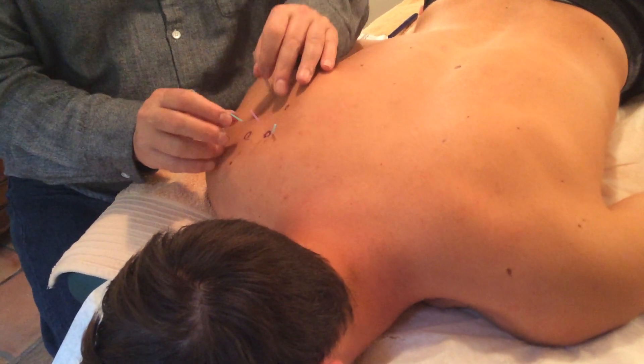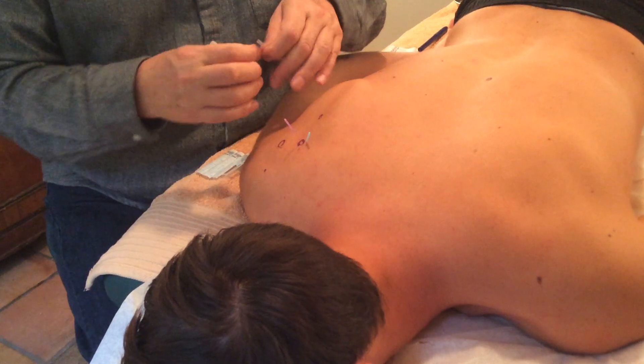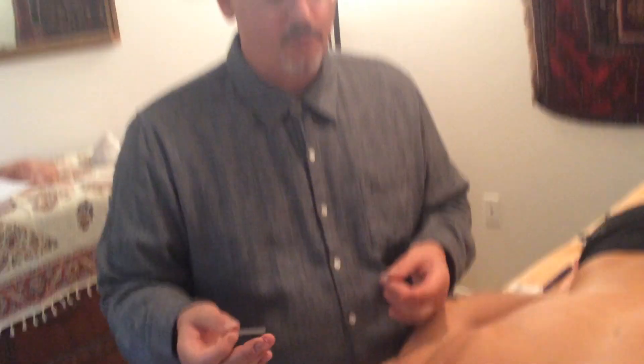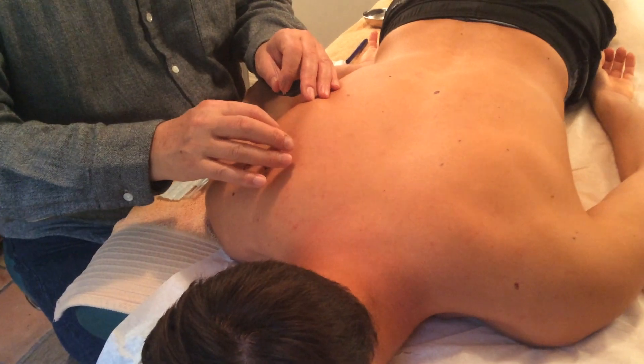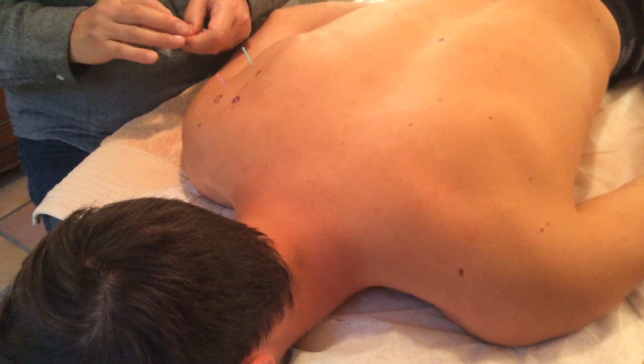The blue needles are thinner than the purple needles — needles come in different sizes and lengths. I'll needle it from an angle. You feel that one? It's really sensitive in there. Another byproduct of this kind of acupuncture is that you do feel sore afterwards — it's like a post-workout soreness. The pain you came in with will normally be better and you'll feel really loose, but you may have that post-workout soreness. I associate that with going to feel better. I'm going to needle this one and then I'll do this one.